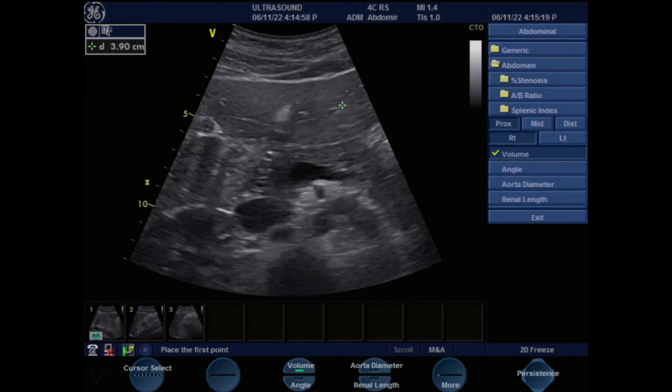Look very white, like how the liver looks gray on here, the more fatty the pancreas, the more it looks white. Is it your judgment call sometimes? Yes, because the gray is thin, thick. Do you have a measurement of that? No, we don't have the measurement.